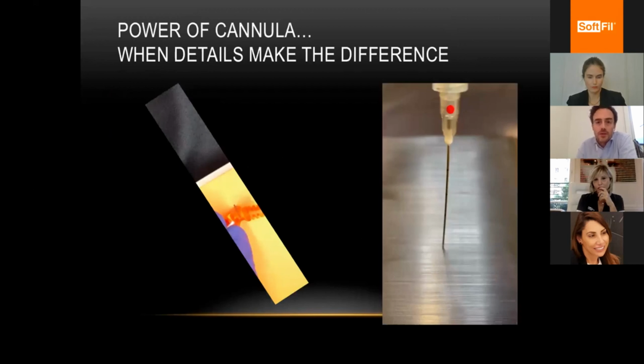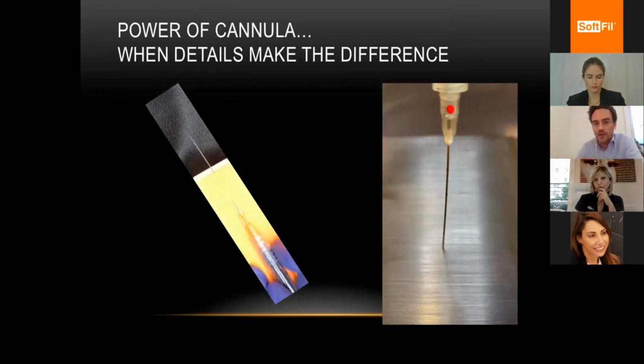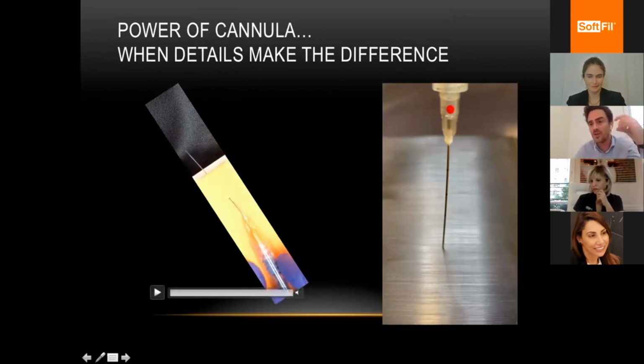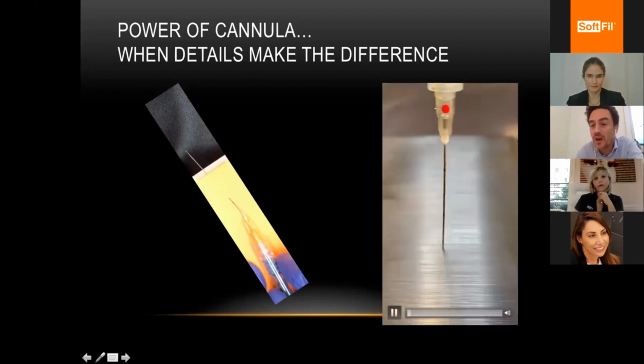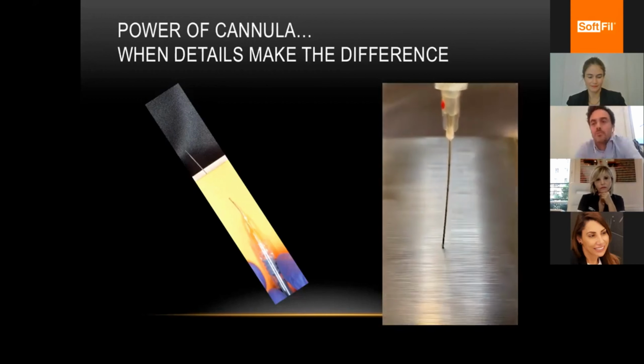The power of the cannula, why? Because I think it is when the detail makes the difference. Why? Because you can play with the flexibility of the cannula, as I show you here. You see, with one entry point, we play with the flexibility. We can reach practically every part. Of course, you need training. There's a learning curve. But you can reach everything, pricking your patient less, which is something that I really like. Of course, if you use your non-dominant hand, you feel it and you guide it wherever you want, as I will show you with some cases that I prepared for you. Also, it's very important to know where this red dot is, because we know where we'll inject. And particularly, it helps me a lot when I'm treating the nose, where really a small quantity and the detail will make for sure the difference, particularly when we are treating asymmetries.